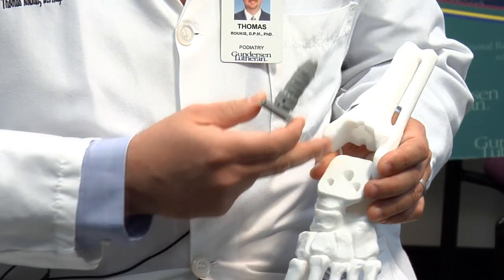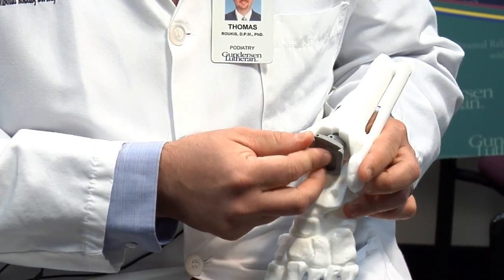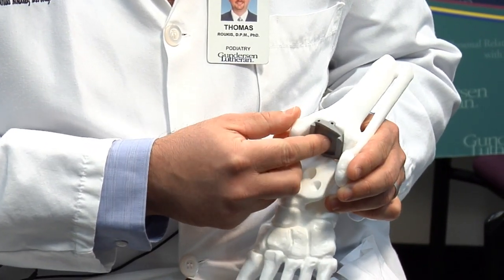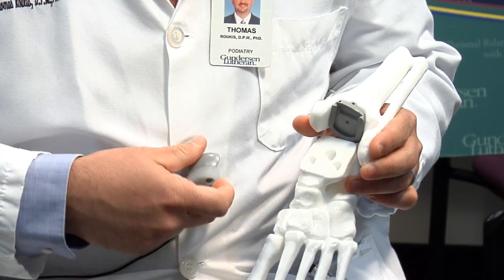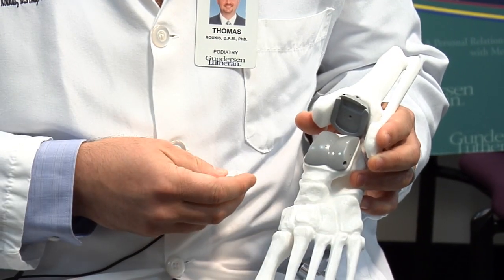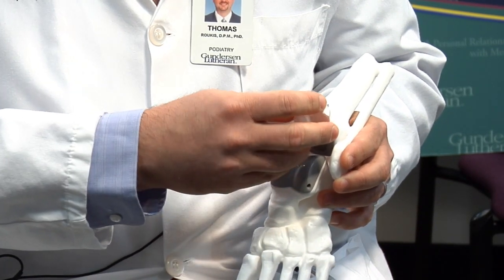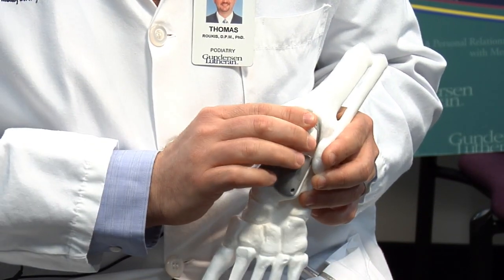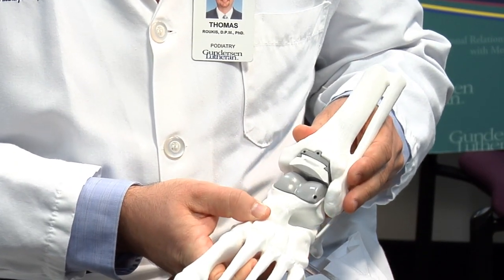First, the lower part of the shin is removed and replaced with a metallic component that goes inside of the shin and resurfaces the end of the shin bone. Next, a component goes on top of the foot and replaces the joint surface at that level, and then this is followed by insertion of a plastic liner that clicks into place and replaces the cartilage, acting as a cushion.